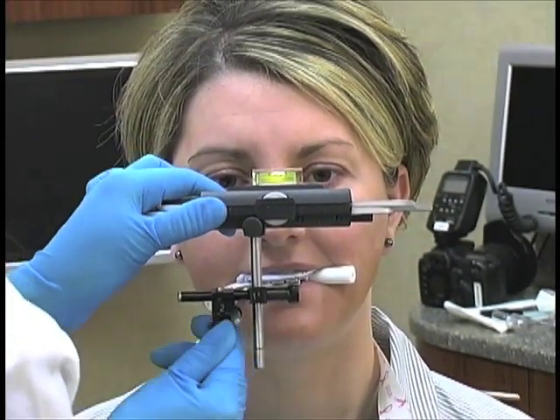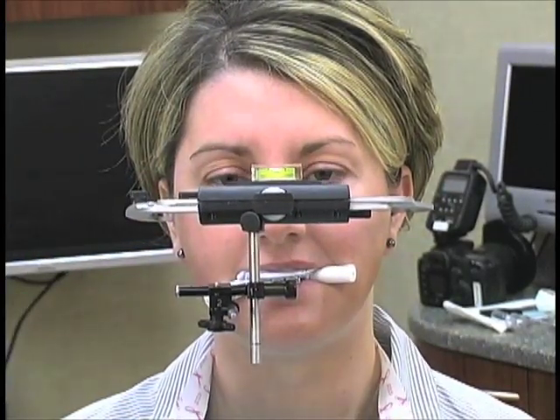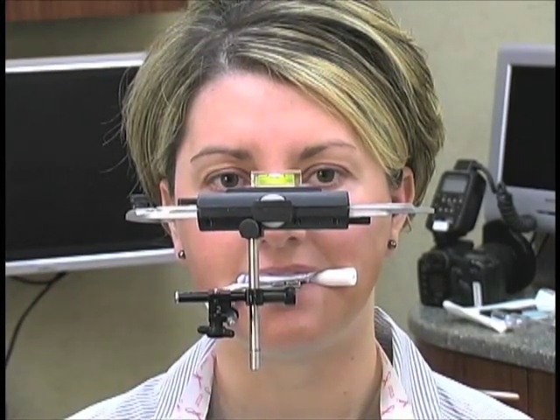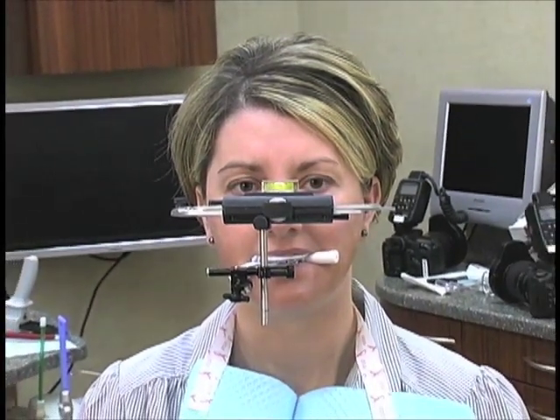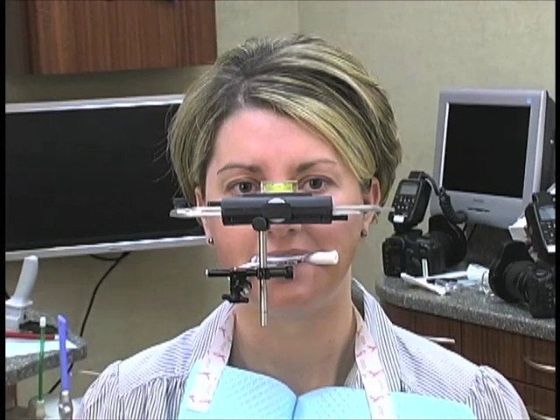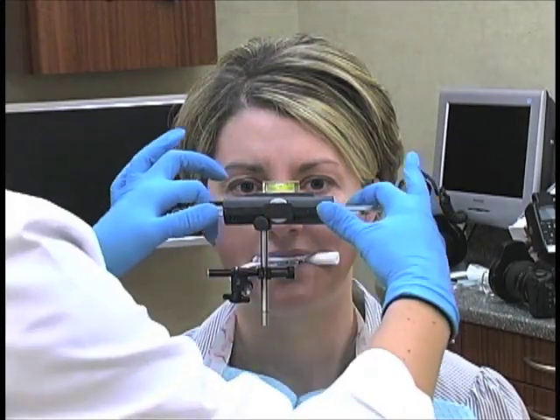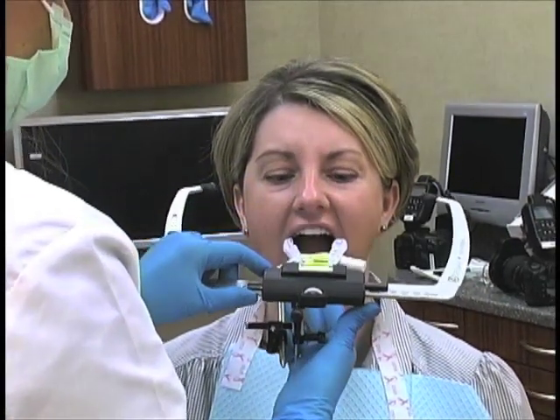What we've just accomplished is taking this face bow so that it's properly centered on the articulator vertically, and paralleled so it'll be directly parallel with the top of the articulator. Any cants that exist in this patient will be seen on the articulator — that maxillary cast is going to be hanging on that instrument exactly how the maxilla is hanging in the patient's head. At this point, all we have to do is loosen up the face bow, the patient opens up, and we're done.